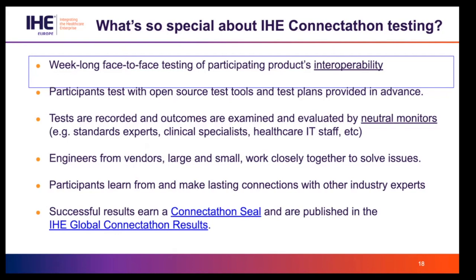There's rigor in the recording of that exchange and the examination of the results, which happens in the IHE Connectathon with the observation by the neutral monitors, which are really the secret sauce that makes this all happen.